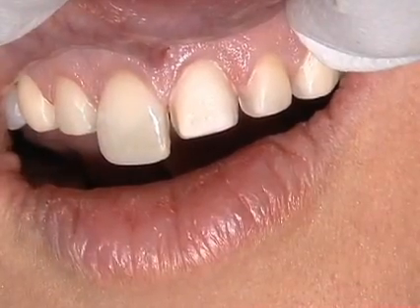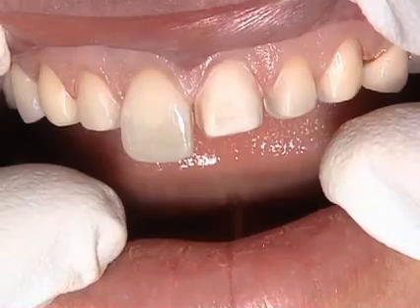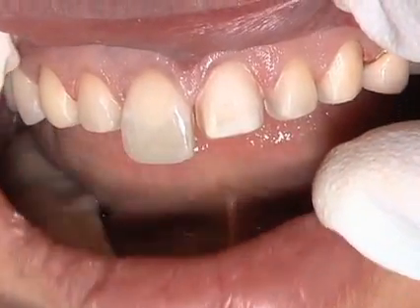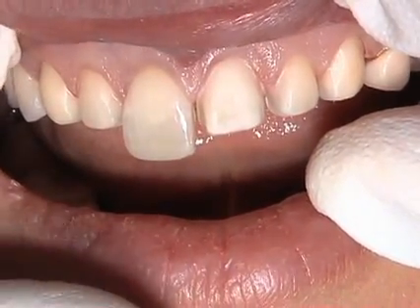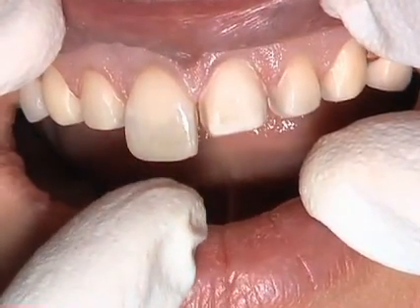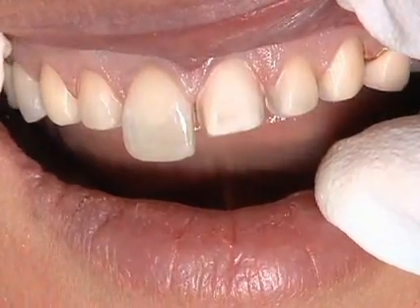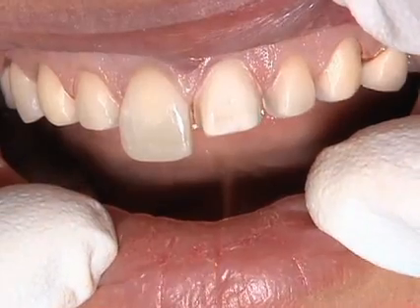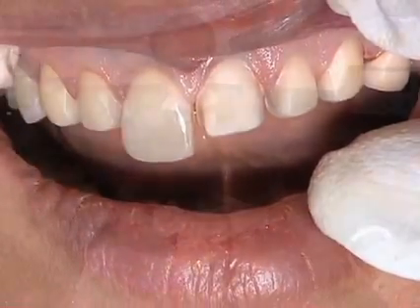The interproximal finish goes interproximally, so it will not be seen. One option at this point is to take an impression with the unprepared tooth. It would be an excellent way to control the length of the definitive restoration and facial position. If you haven't prepared the interproximal of the unprepared tooth, it can also be used to confirm midline location. Of course, we would need to take a second impression after this tooth has been prepared.